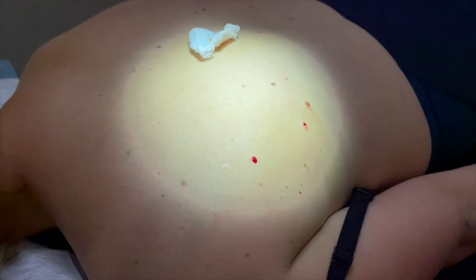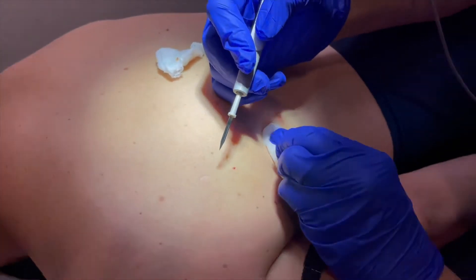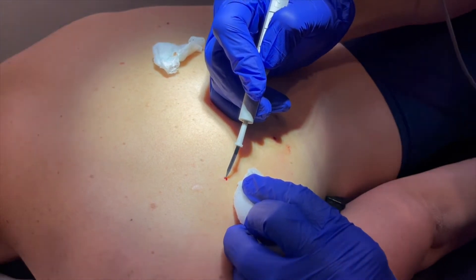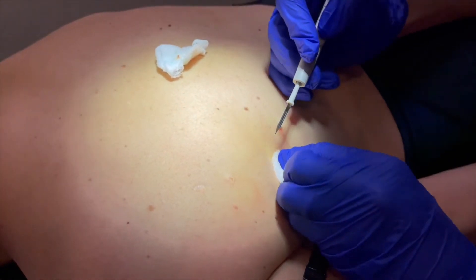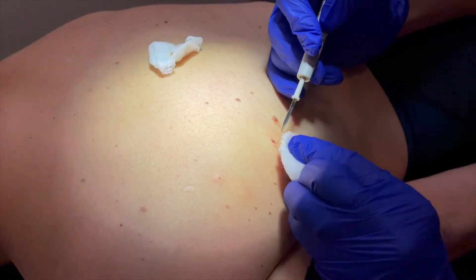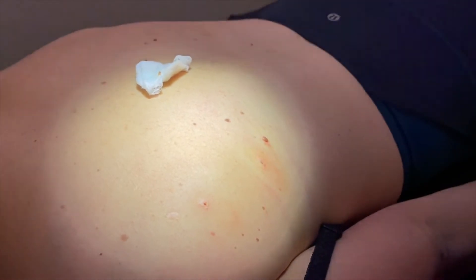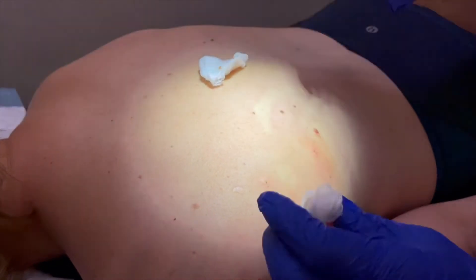Okay, that's been shaved off. Now this is the electro-desiccation. Okay, so it's coagulated and the bleeding stops.